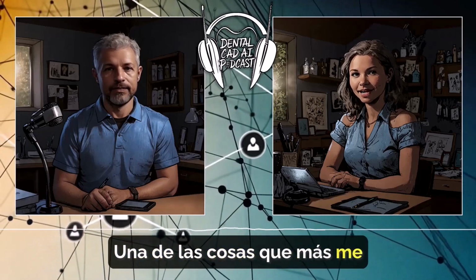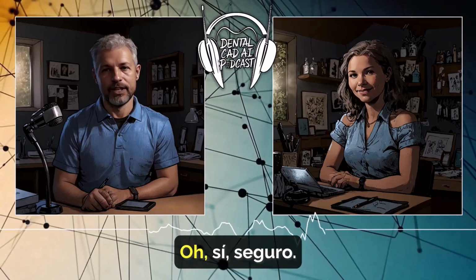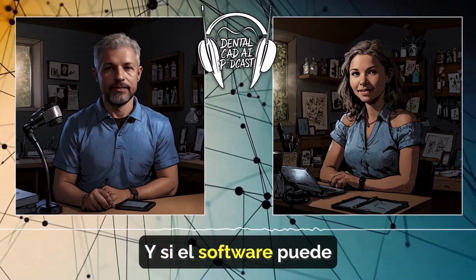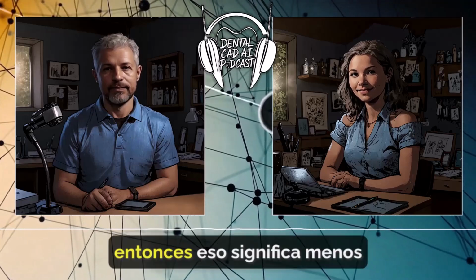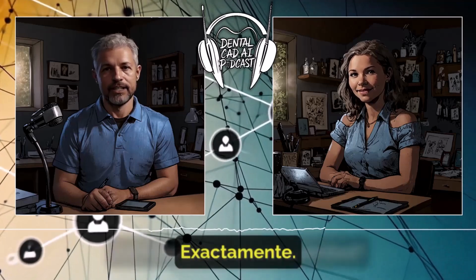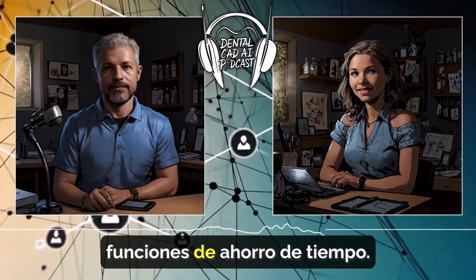So one of the things that caught my eye is how they're really focusing on making the whole process more efficient. Oh, yeah, for sure. Dentists have a lot to do. Right, and if the software can streamline those tasks, then that means less time in the dentist chair for all of us, right? Exactly. So less chair time. Yeah, I'm all for that. So tell me more about these time-saving features.